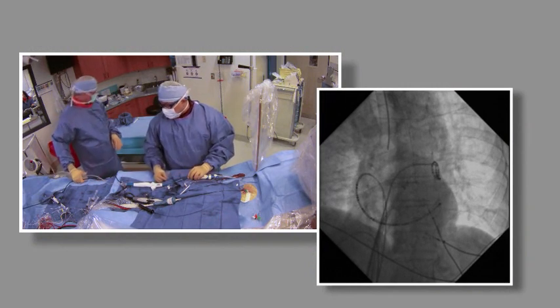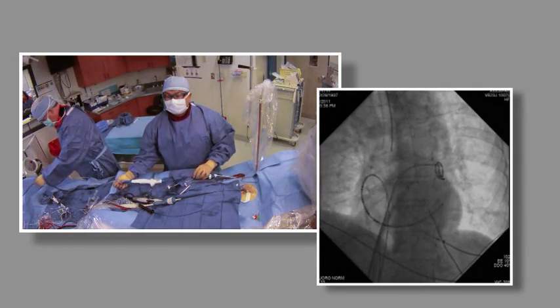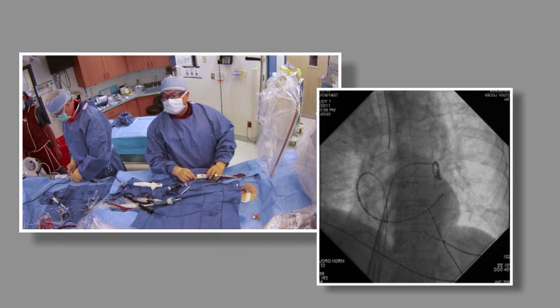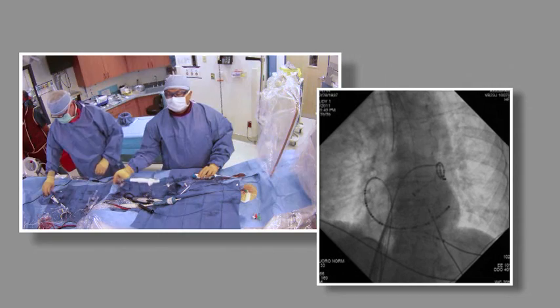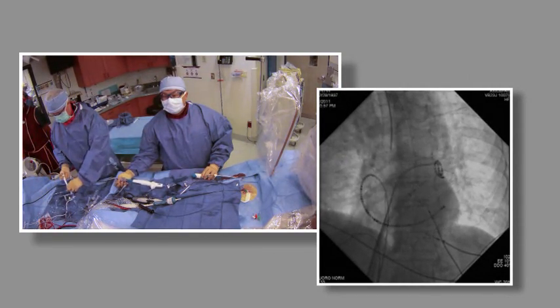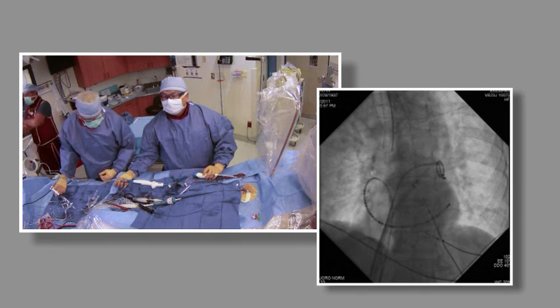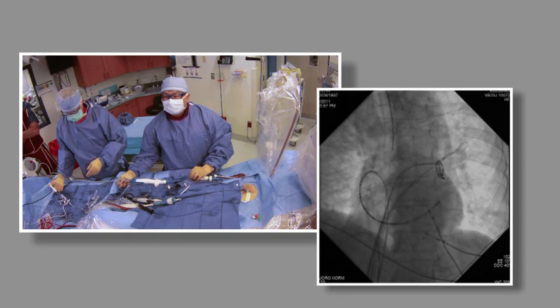We have a fluoroscopic marker — the balloon is out. I'm going to expose the wire so that will track things well. On the LAO view I have a nice angle to see where I can track into the vein. That's my marker for the left side of the vein. We know it's a common ostium and this will be the inferior, but I like to go for the superior first if it will go there.